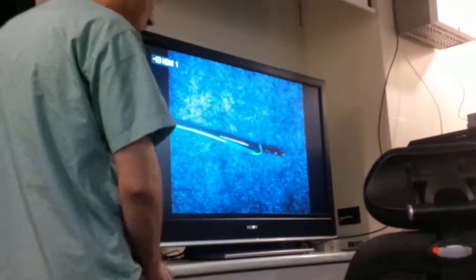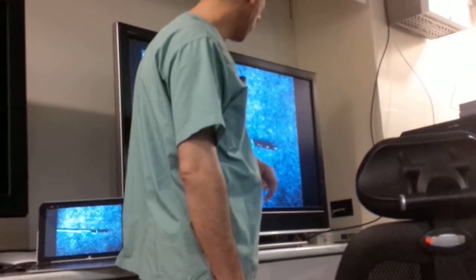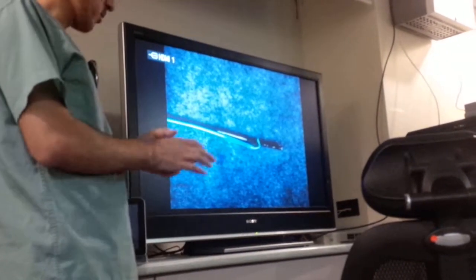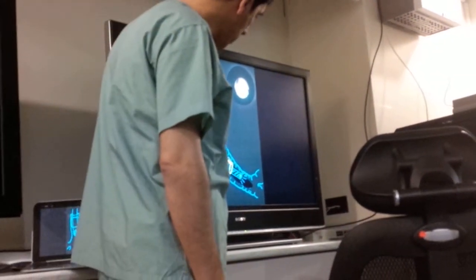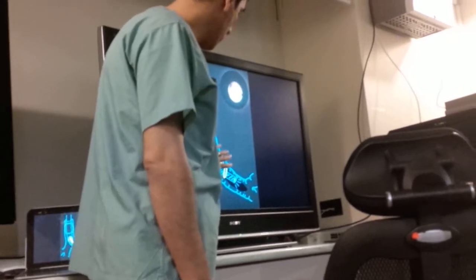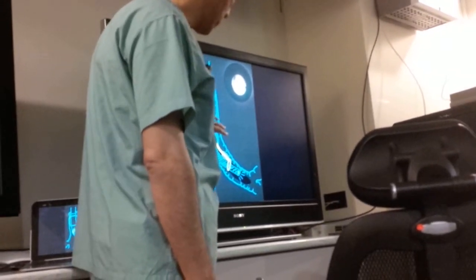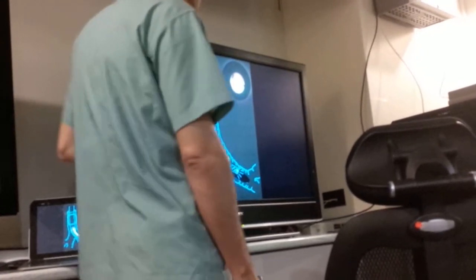Here we hang the bronchoscope with the loop at the tip of the bronchial blocker. We hang it and we pull the snare from outside, so it will be one piece. Then we go together with the bronchoscope and the bronchial blocker. We go with the bronchoscope to the left side if we want to isolate the left side. Where you want to fix it, in the left side, then you loosen the loop, the snare, and pull the bronchoscope up to the tip here to see the cuff where it's inflated in the left side.